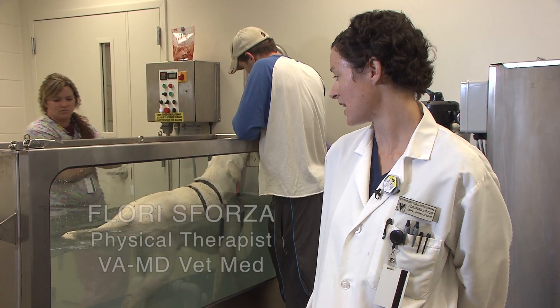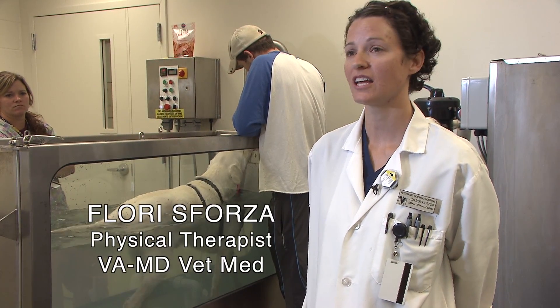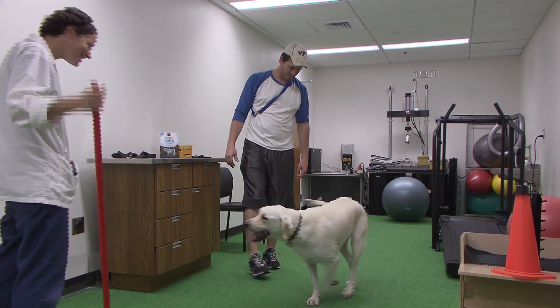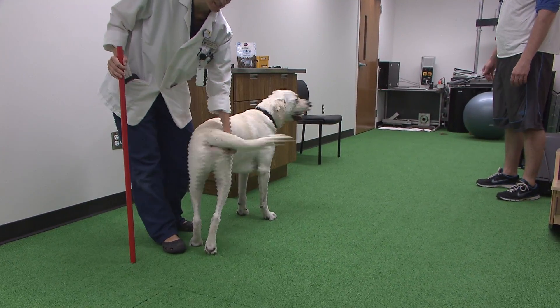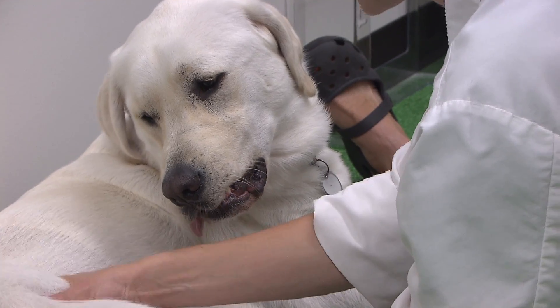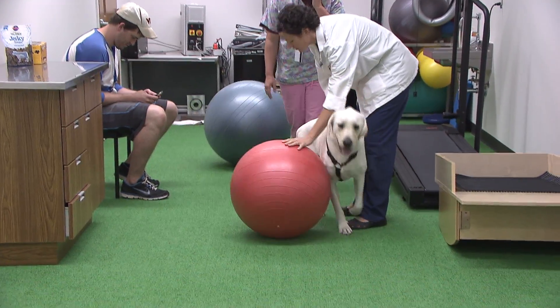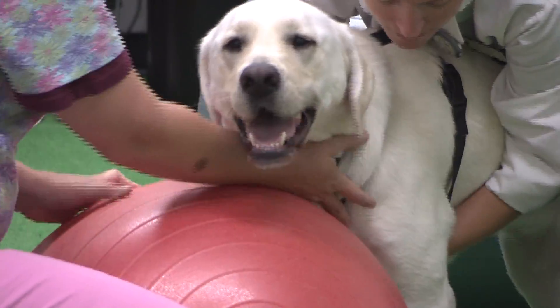Today we're with Baxter, a two-year-old yellow lab male who has hip dysplasia on both sides. When he first came to me it was about three weeks after he had his surgery and he wasn't using his limb at all. We started working with him, putting him in the underwater treadmill and doing ball work, balancing exercises, and strength training — the same sort of thing you would see in human physical therapy.